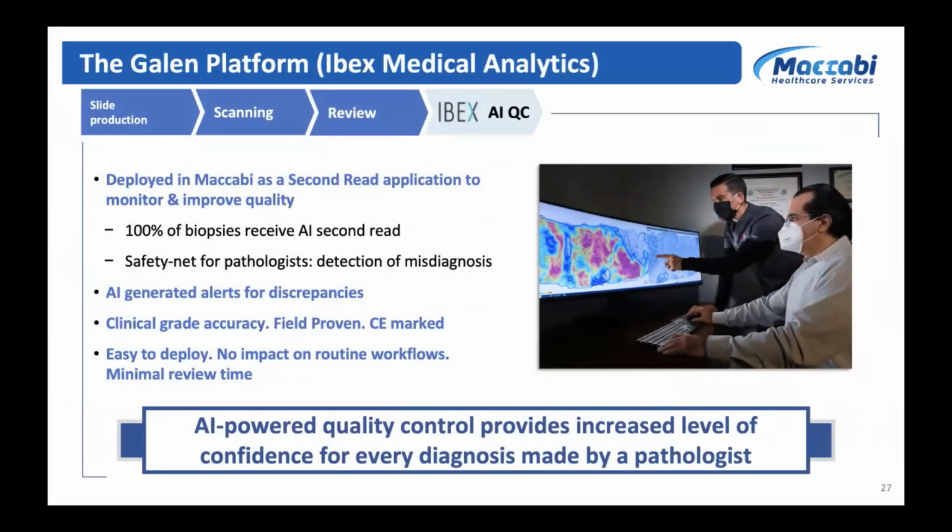And now I can say that the algorithms that were developed and others that are on their way represent one of the most exciting revolutions that pathology has experienced. We are actually deploying AI in our routine practice, a clinically very active pathology department, in order to perform more accurate and more timely diagnoses.